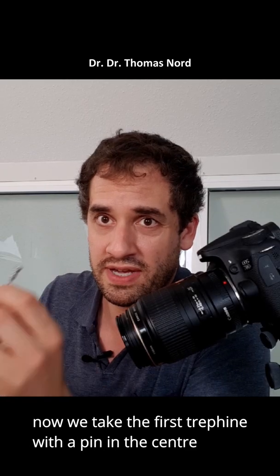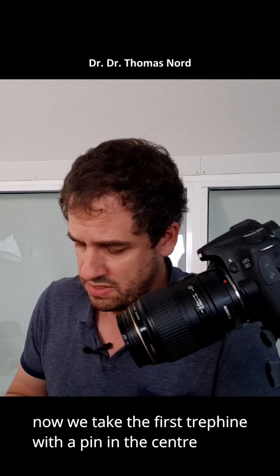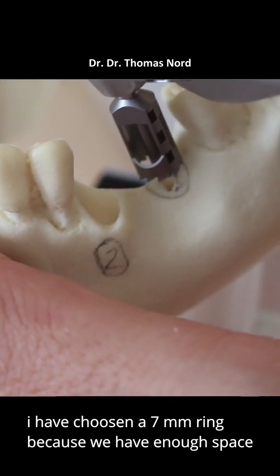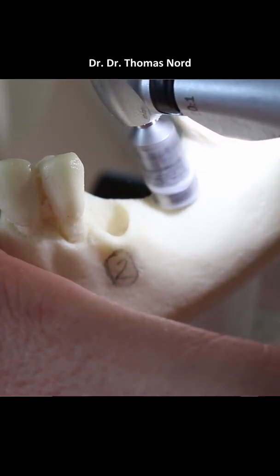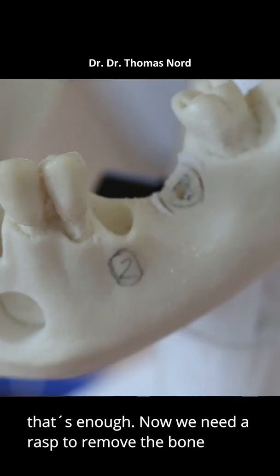Now we take the first trepine with a pin in the center. I've chosen a 7mm ring because we have enough space. That's enough.